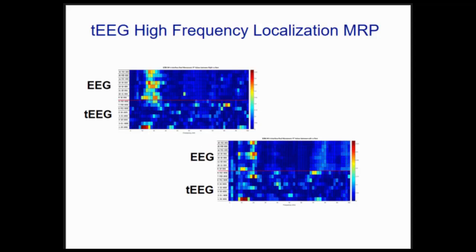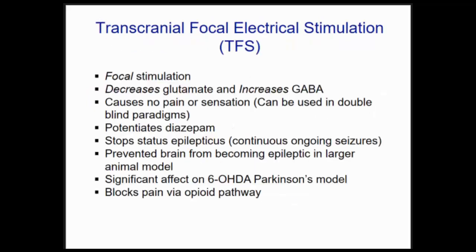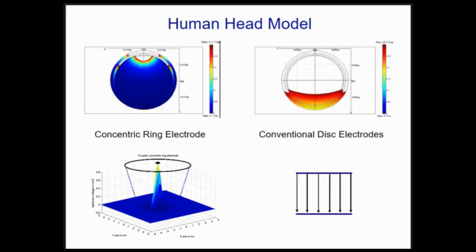And then just trying to localize some actual, physical hand movements. So right hand here, and we can see in the tripolar that this is the C3 location, but we're also getting some high frequency activity up here around 80 hertz. Regular electrodes here, it's hard to pick out which one you would want to use. Left hand in this case, and we're still seeing some higher frequency activity up here as well that's not seen in the regular EEG. But we should talk a little about the stimulation as well.